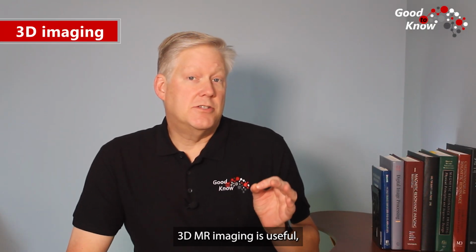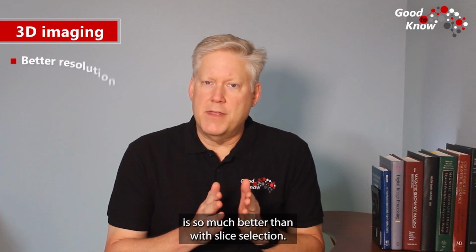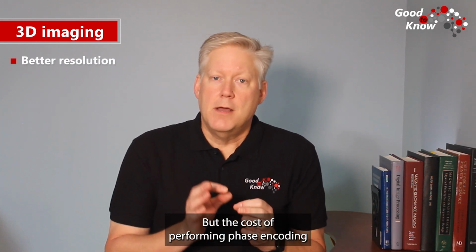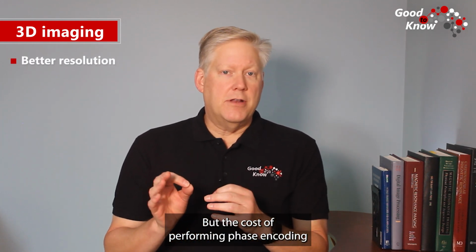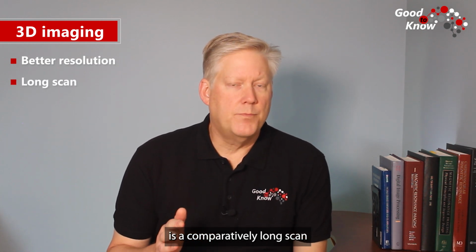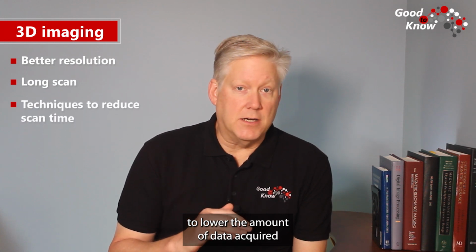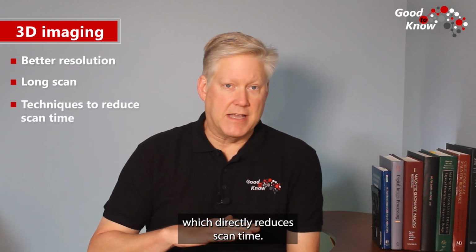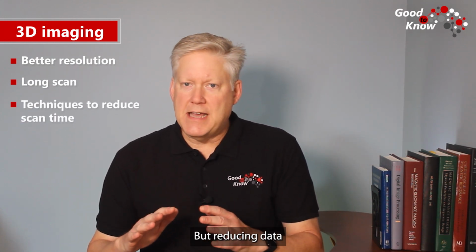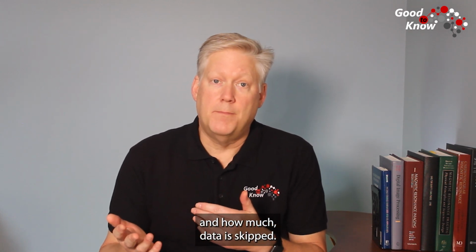3D MR imaging is useful because the resolution in the third direction is so much better than with slice selection. But the cost of performing phase encoding in 2 of the 3 directions is a comparatively long scan. Many different techniques have been proposed to lower the amount of data acquired, which directly reduces scan time. But reducing data brings trade-offs depending on what and how much data is skipped.